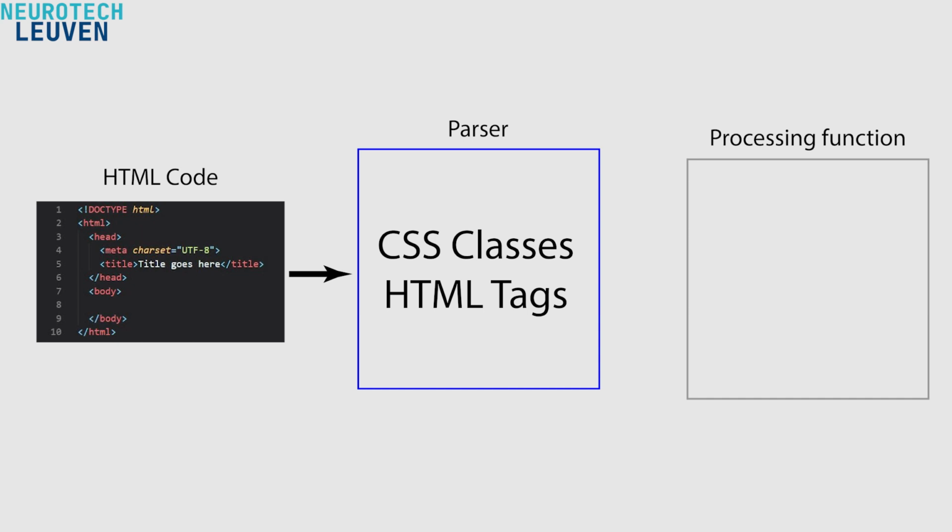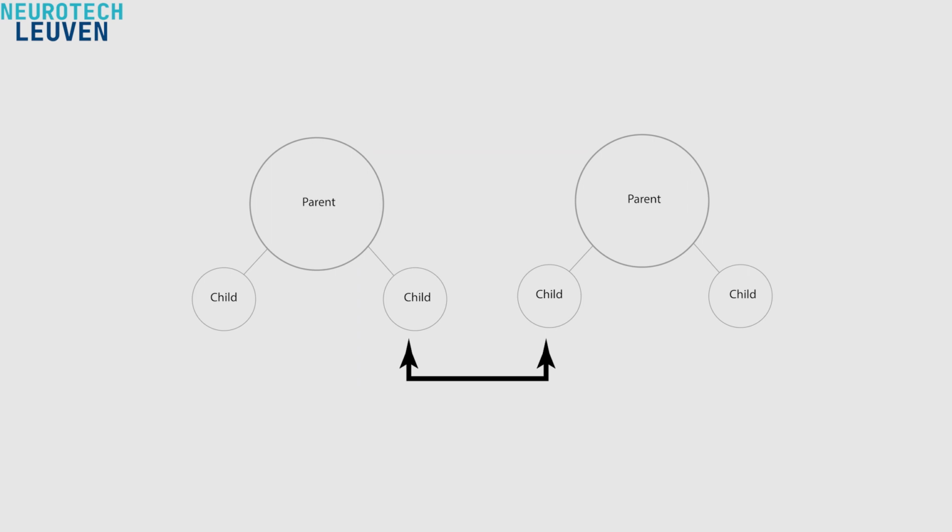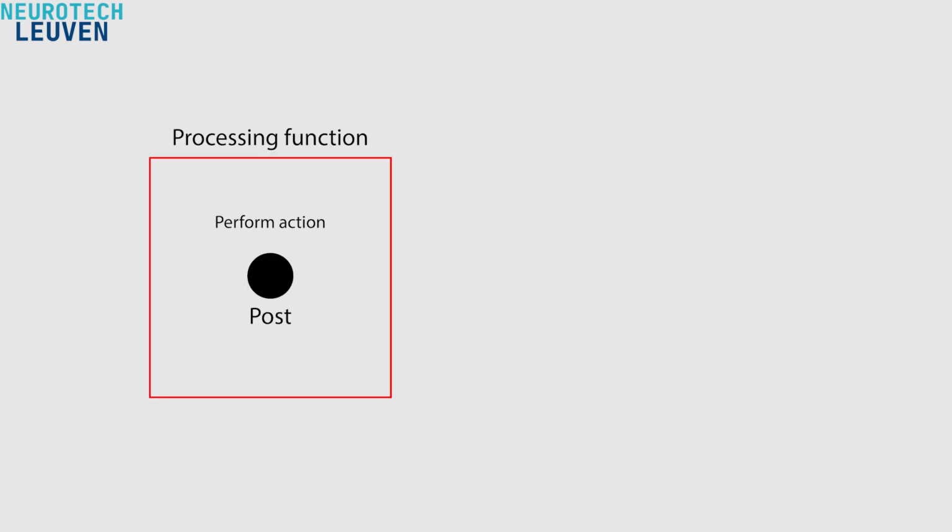The parser finds specific elements in the HTML code using CSS classes and HTML tags. HTML elements that have the same class can be differentiated between using their parent containers. Once the elements of interest have been found, a processing function executes an action.